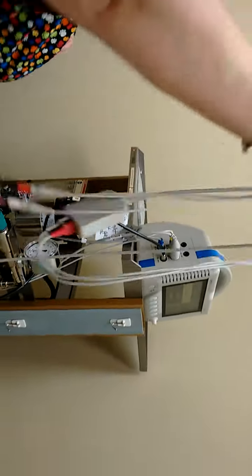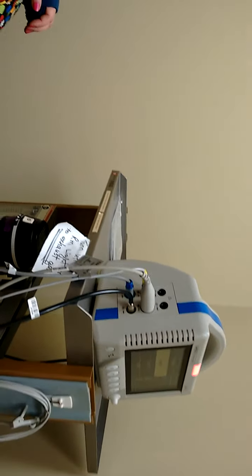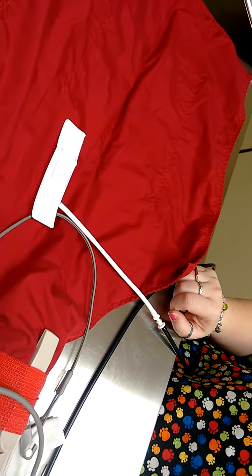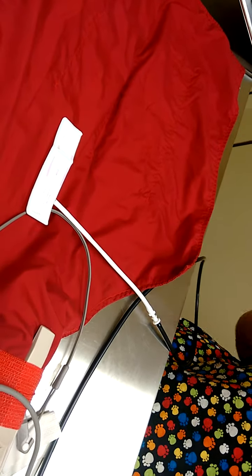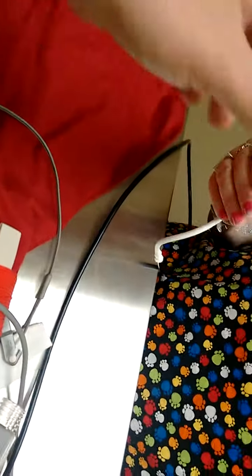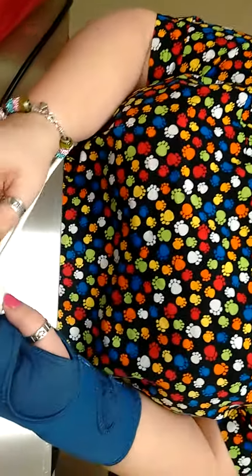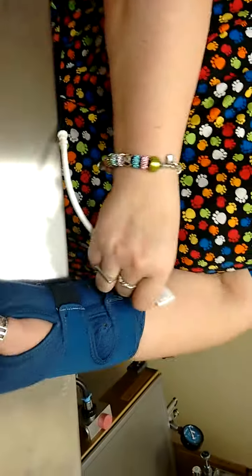And what about the blood pressure? You have to make sure you get the right size cuff for the animal. How do we get the right size? I just know. I know there's a calculation, but this would be too small for the Frenchie. I would need a 3 for the Frenchie. We're going to use a 3 for him. You always have this side toward the patient, to the artery, here where the tube is.